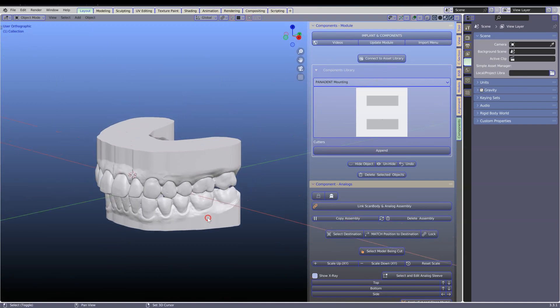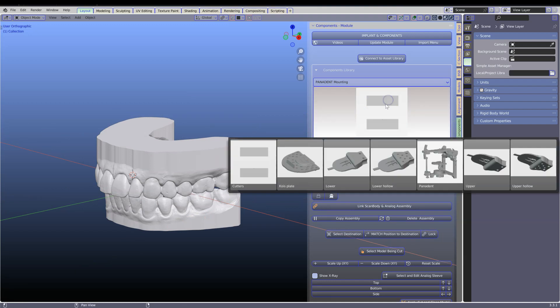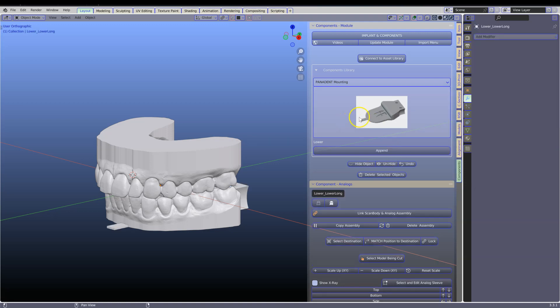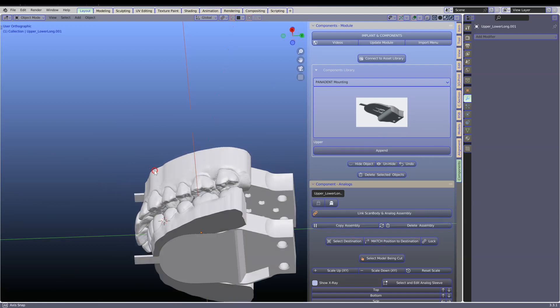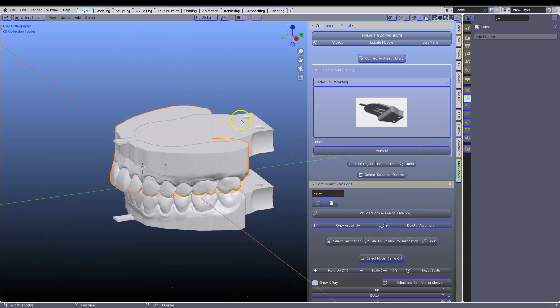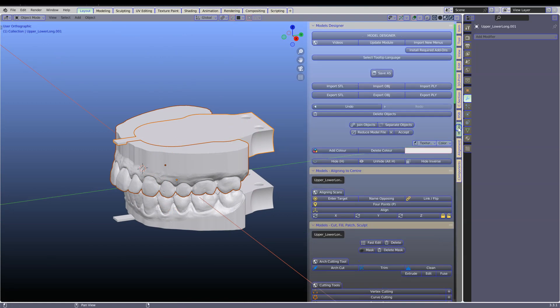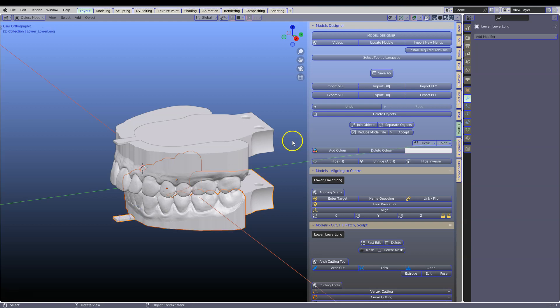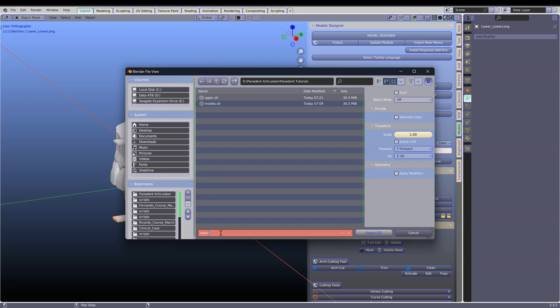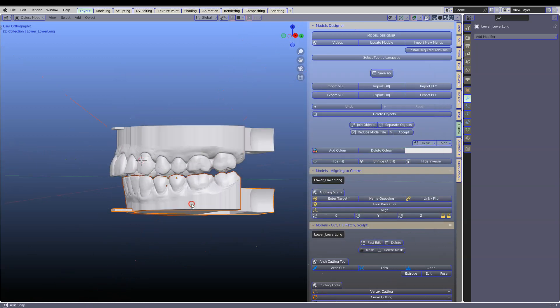We now have two models. Finally, choose your mounting plates — these can be perforated or non-perforated. I'm going to be selecting the non-perforated. That's one, and then grab the upper as well. Everything has been trimmed and cut correctly. Select the two of them and export these as STL. Name them, selection only. Do the same with the lower — make sure you click the Selection Only button — and then send these to your printer.